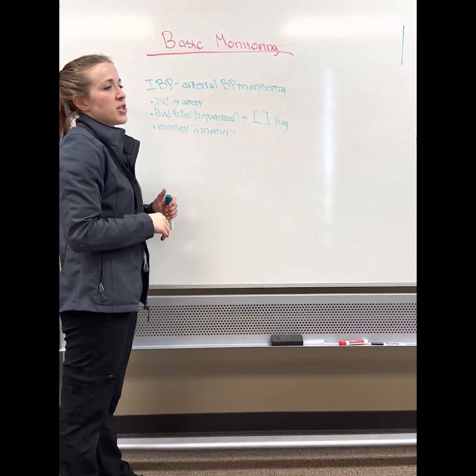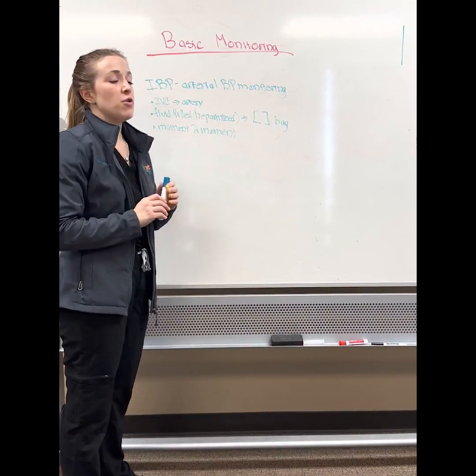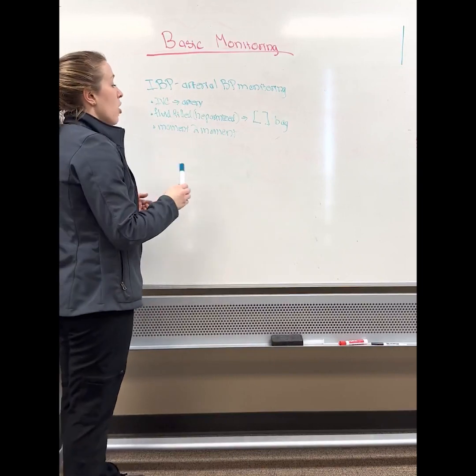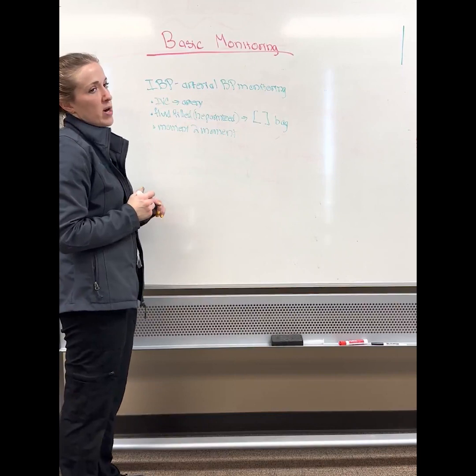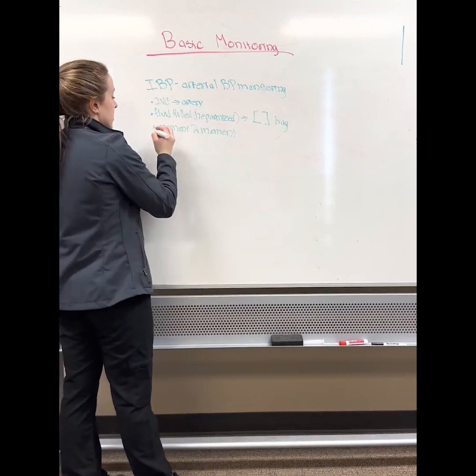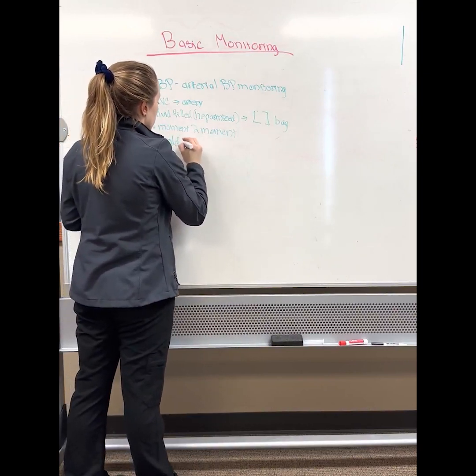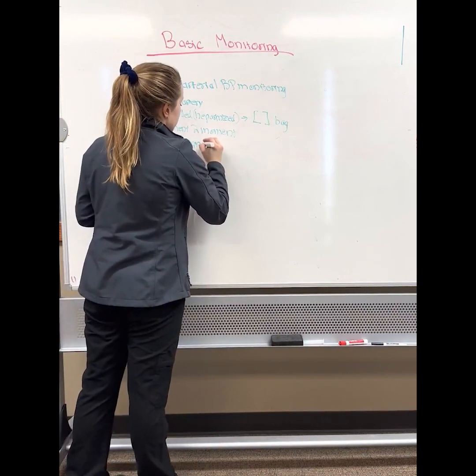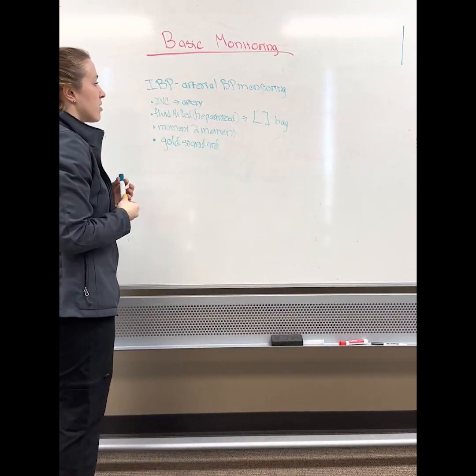So if you have a patient that has arrhythmias, a terrible lung disease, or an open chest surgery, knowing what the blood pressure is every single moment is going to be more helpful than a snapshot every 5 minutes. So this would be the gold standard for that particular type of patient. Not every patient needs an arterial line, but it can be incredibly helpful when you do need it.